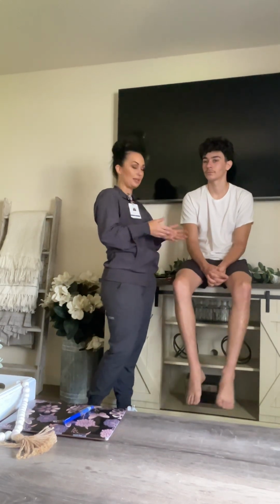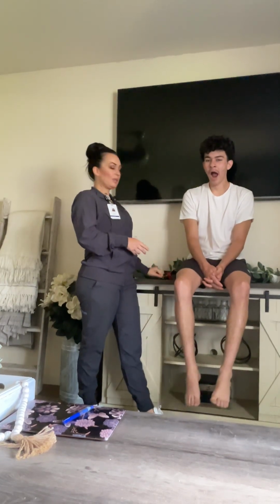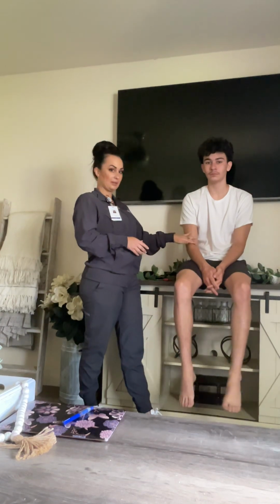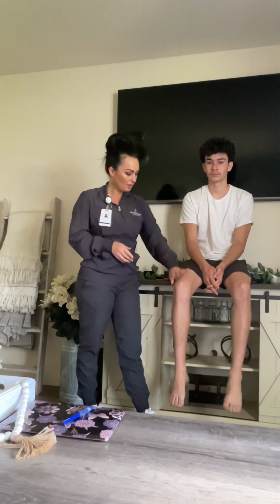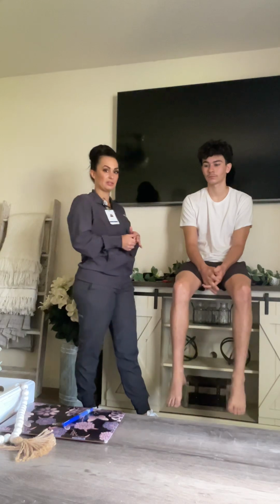So we will start by assessing your reflexes, and we are going to do this with the reflex hammer. I'm going to gently start by tapping on 4 areas. This is going to begin with biceps, your triceps, your patellar, and then we're going to go down to your Achilles tendon. Doing this procedure is going to help check your body's reflexes and motor system function.